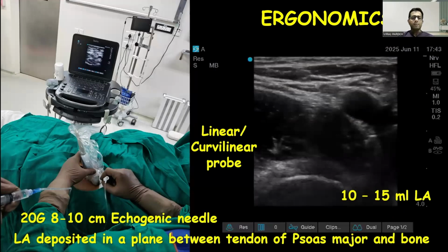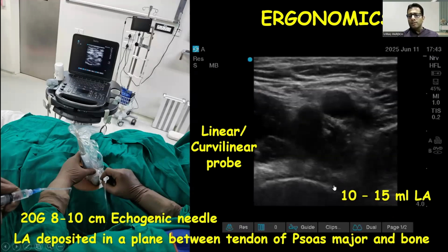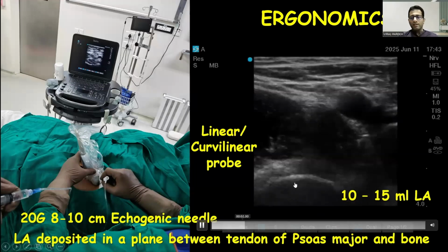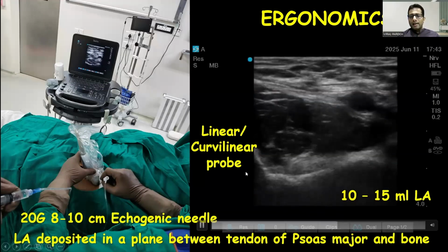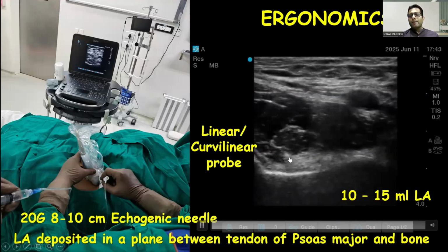A 20 gauge, 8 to 10 centimeter echogenic needle is required, and the local anesthetic is deposited in a plane between the tendon of the psoas major and the bone. In this ultrasound image, this is the head of the femur. I am going from the level of the inguinal crease to above. As I move cranially, we can see this classical image with the psoas tendon and the iliopubic eminence. The needle will come from the lateral aspect, and we can deposit around 10 to 15 ml of the local anesthetic.